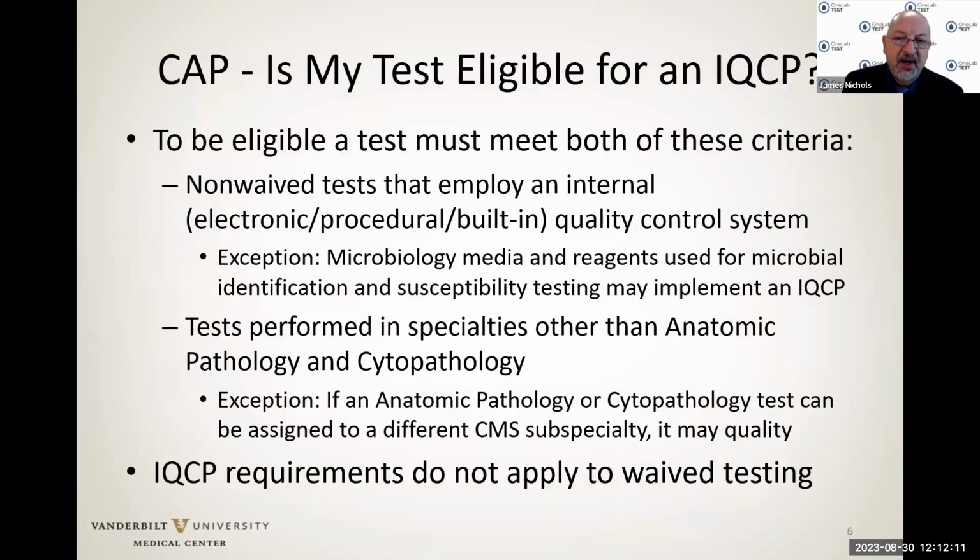Now, many laboratories are accredited by the College of American Pathologists. They similarly have recommendations for laboratories to ask, is my test eligible for an IQCP? And to be eligible, the test must meet both of these criteria. It has to be non-waived. But I will say, even though it is non-waived, all laboratories can benefit from running a risk assessment and developing a quality control plan, even for all of their waived tests. And many of the test systems I'm going to discuss today are CLIA waived.